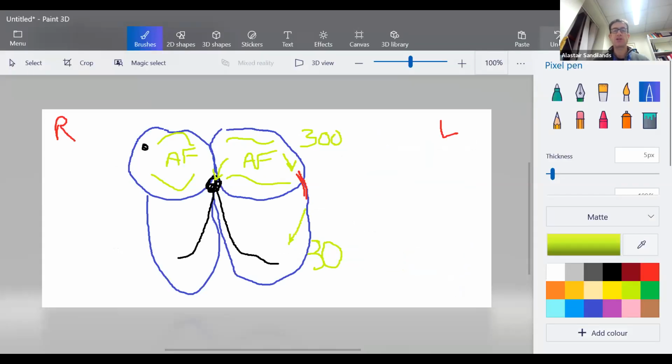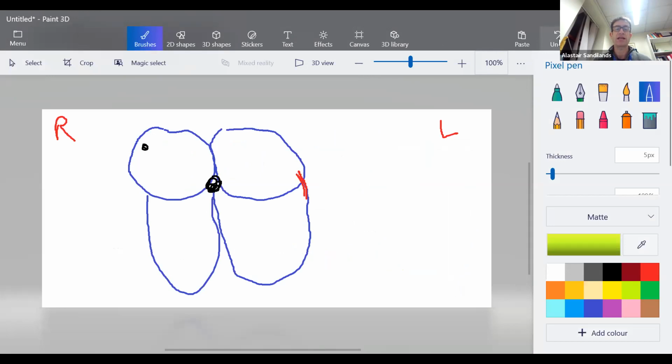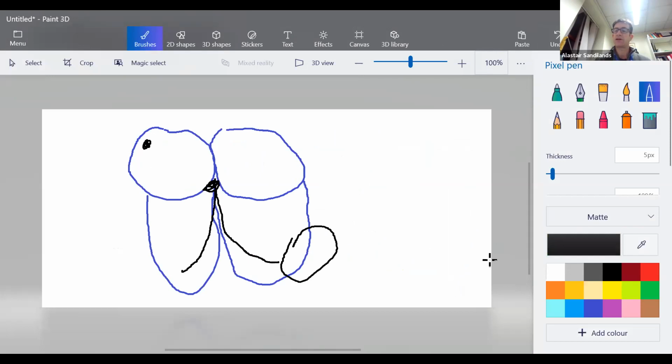So let's just go back. Before we look at the ECGs, I want to describe pictorially what we mean by fusion and capture. Okay, so let's pick a color. So sinus node, AV node, right and left bundles. So let's just say we've got a scar here. Okay, let's make it red. So there's a scar in the muscle here. This patient had a heart attack years ago. They've got a small scar.